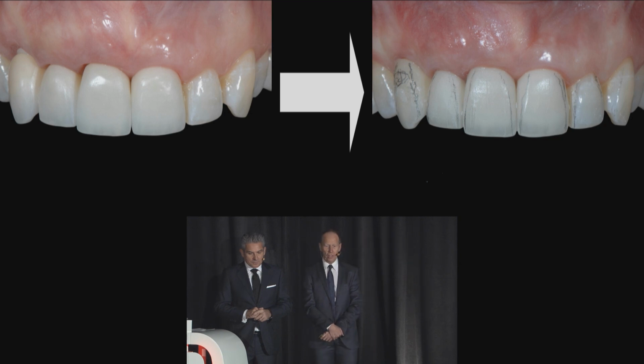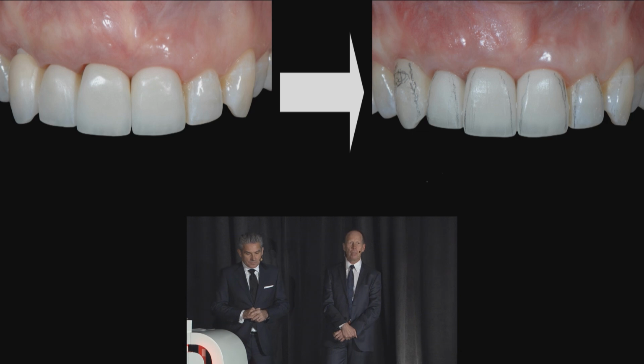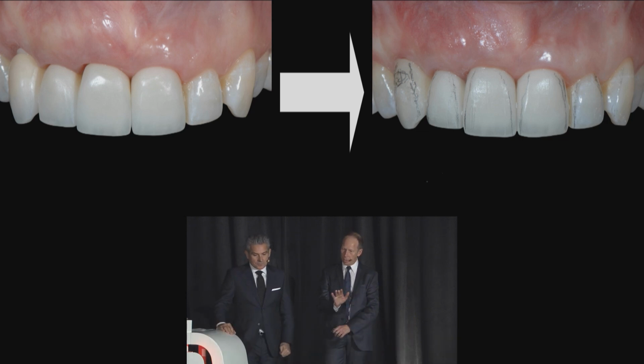So first of all, there was a problem with the canine, of course. It was a little bit too short. So Iñaki built up a new model with composite, so that we could fine-tune the length of the canine.